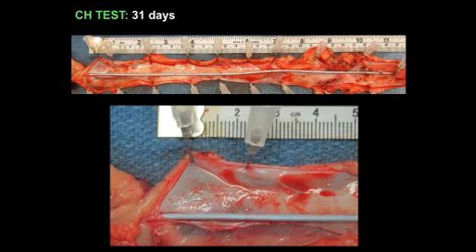In this picture, this was one catheter of all of the test catheters. There's nothing to report here because, as you can see, there is absolutely no fibrin sheath. There is a totally clean vessel wall, and all of the histology sections were perfectly normal. This was one of the three catheters.